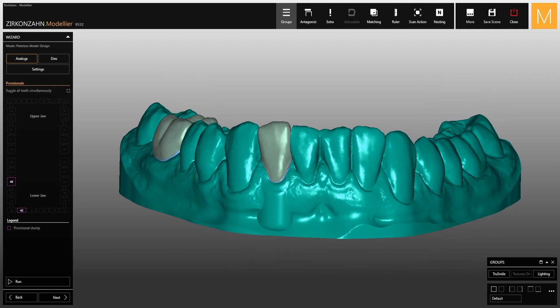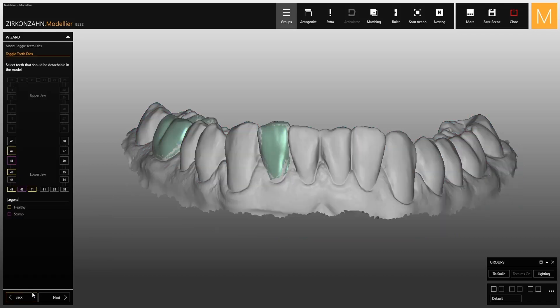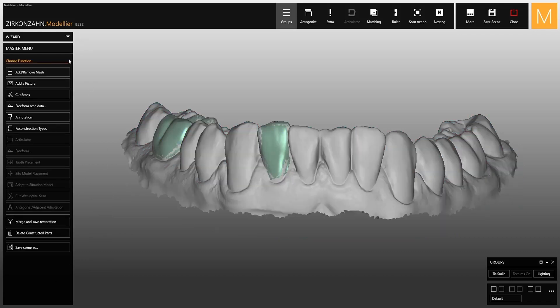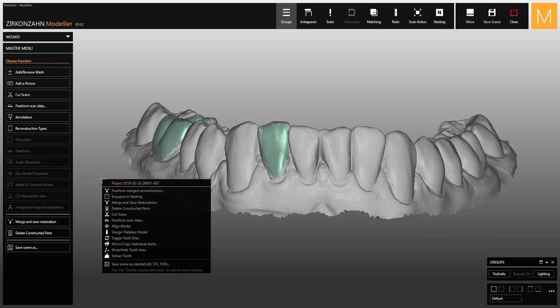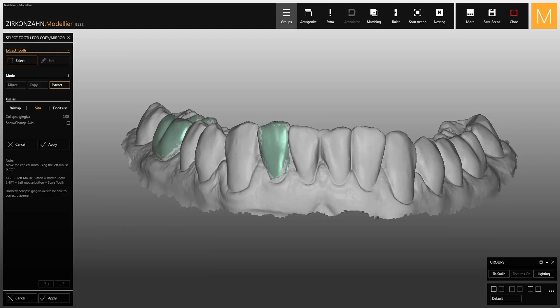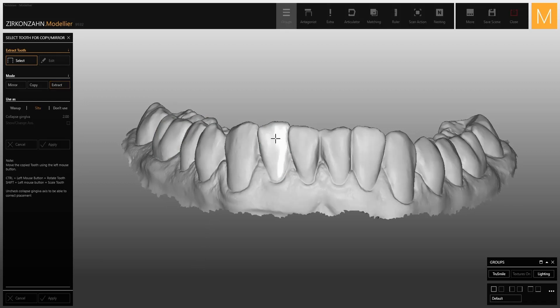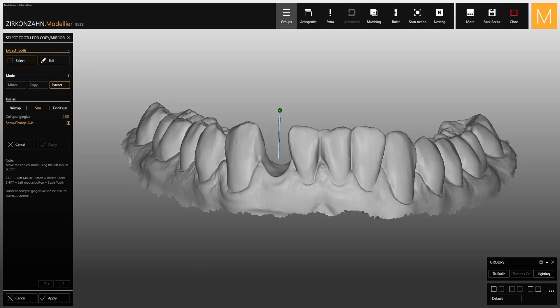If during the creation of this type of model the tooth is not extracted correctly, go back one step, enter the master menu, and click on the background. Among the several options on screen, select the tooth extraction function, then proceed by clicking on the tooth to extract and delete it. At this point, apply the changes made to your scan and return to model creation.